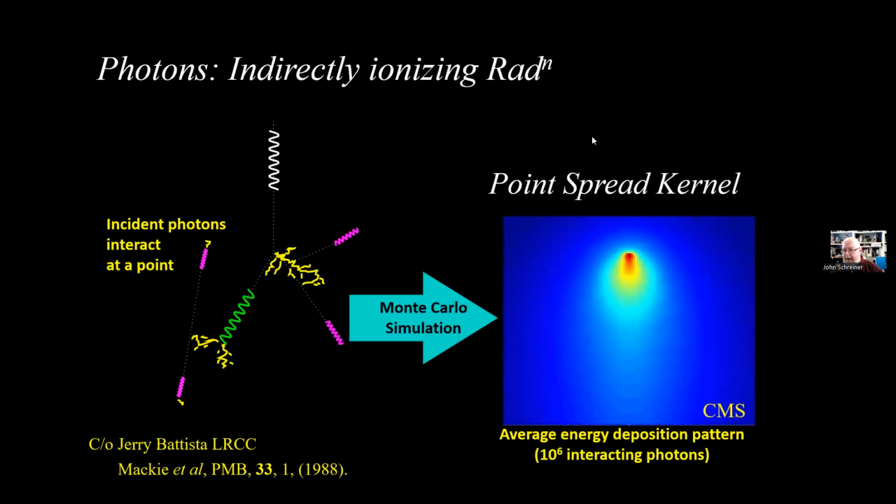So how is that planning done? Well, it's a little bit of that brief physics that I gave you earlier. The planning is based on assuming that radiation is coming in and interacting at some point, and then the dose is being given by the electrons that are traveling after that initial interaction.